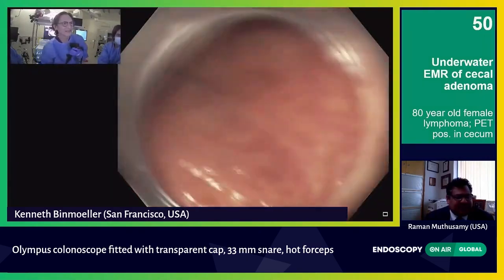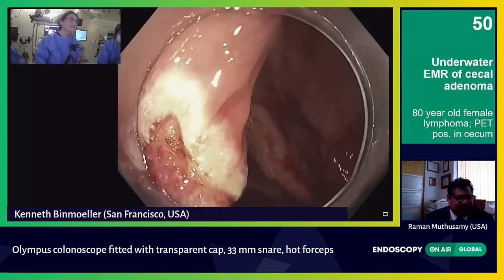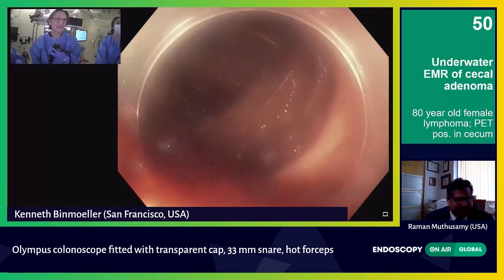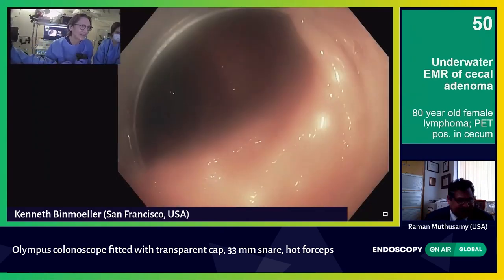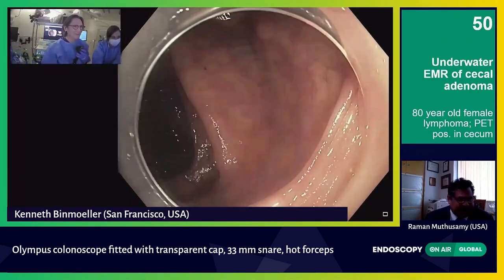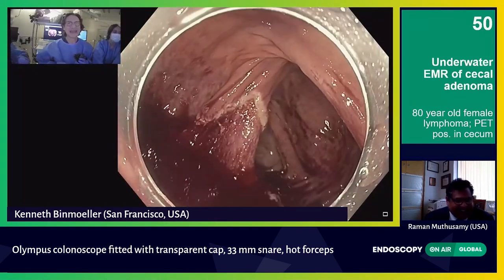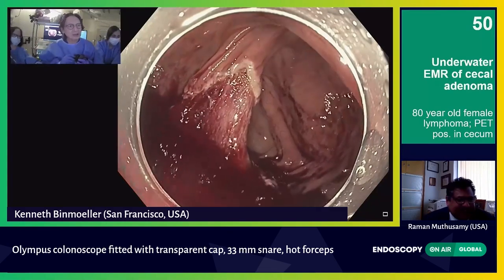Kristen is working very hard with pressure because she was really hard to get to. Here's the resection surface — look at it here, it looks beautiful. Let's see if it's still bleeding. I think it is still. And now I can get the hot biopsy forceps ready. Really working hard to get back in the cecum. Now let's just hold this position — I'm also squatting here to hold my position. Let's see if we can see that bleeding point. You can see there's a bleeder right there.